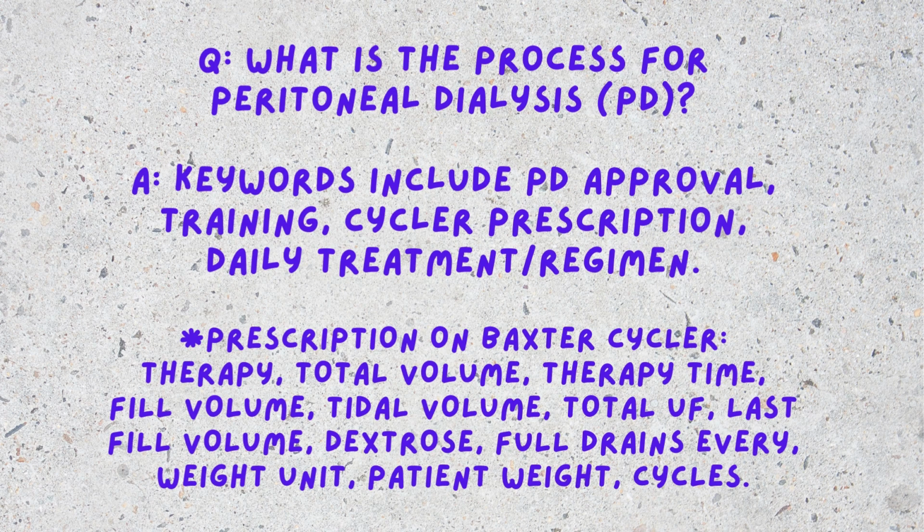So that is it mainly about the cycler, the daily treatment, and the regimen is something that you need to be consistent with. They will be checking up with you. You can also check in with them if you have any questions or concerns. But as I said, you are in charge. You have to take ownership of your treatment. If they see you are not being a model patient, maybe not doing what you're supposed to do.